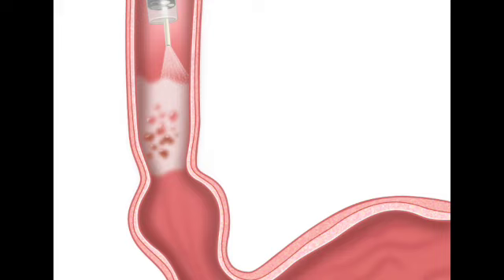This is aceto-whitening. That is fascinating. So the healthy cells undergo this temporary protein shift and turn white. Yep. But the real genius of this procedure has to be what happens to the unhealthy cells, right? Oh, absolutely. What happens if there are neoplastic, dysplastic precancerous cells hidden within that lining? Do they just not turn white at all?